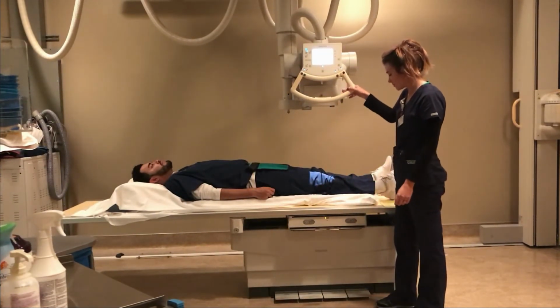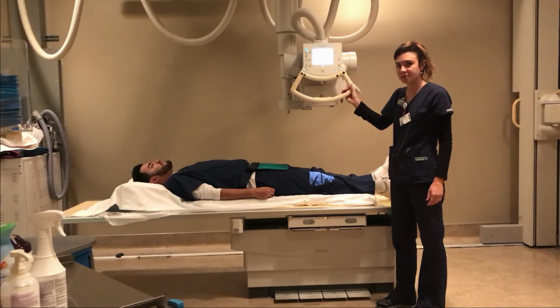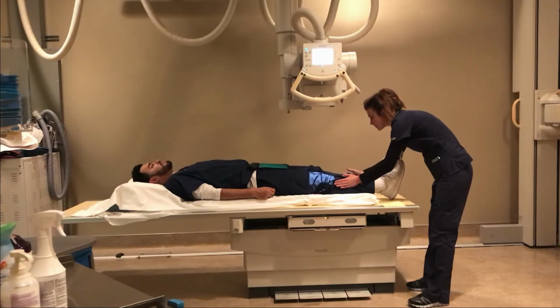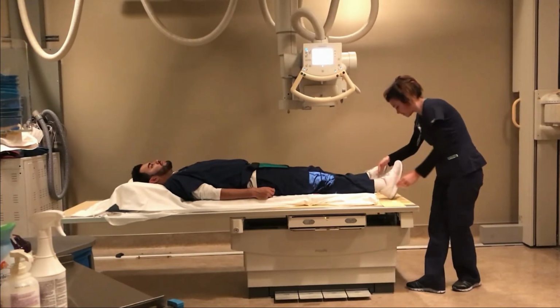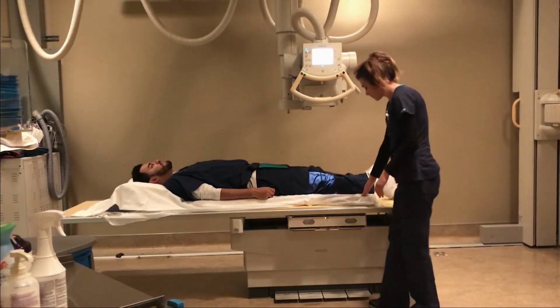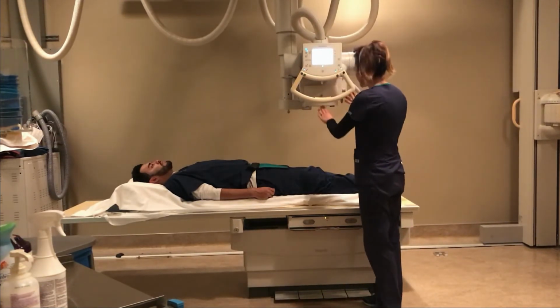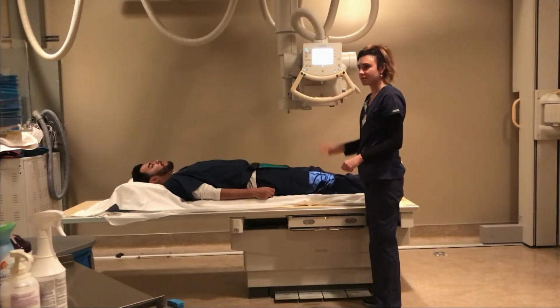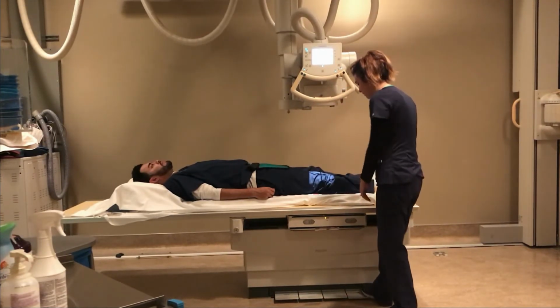And the next one's going to be an AP oblique with medial rotation for the knee. So Phil, go ahead and just rotate your knee inwards just a little bit more. Okay, right about there. And for the central ray on this one, it also enters 1/2 inch below or inferior to the patellar apex.